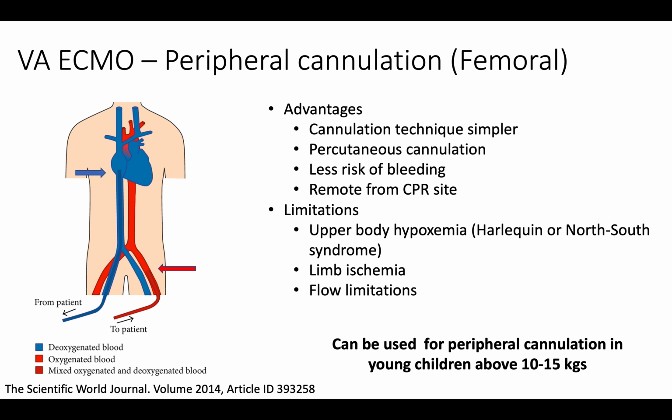A major concern with carotid artery cannulation is that it may increase the risk of stroke. With the femoral artery, the risk of limb ischemia. In addition, in the case of femoral artery cannulation, there is also the risk of upper body hypoxemia, which we will discuss further in later slides.